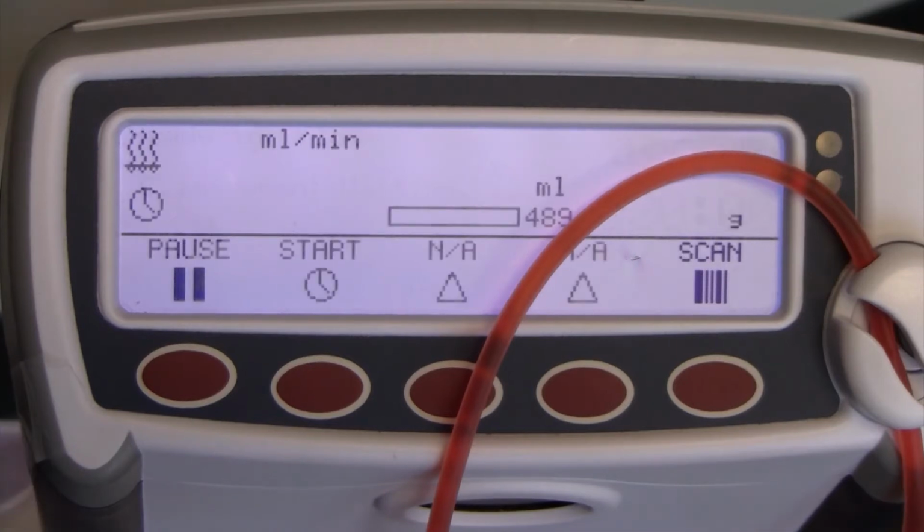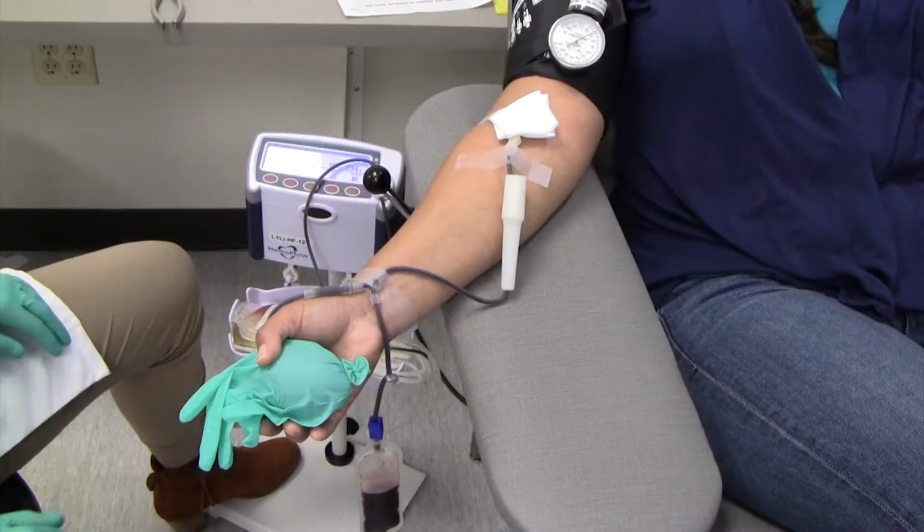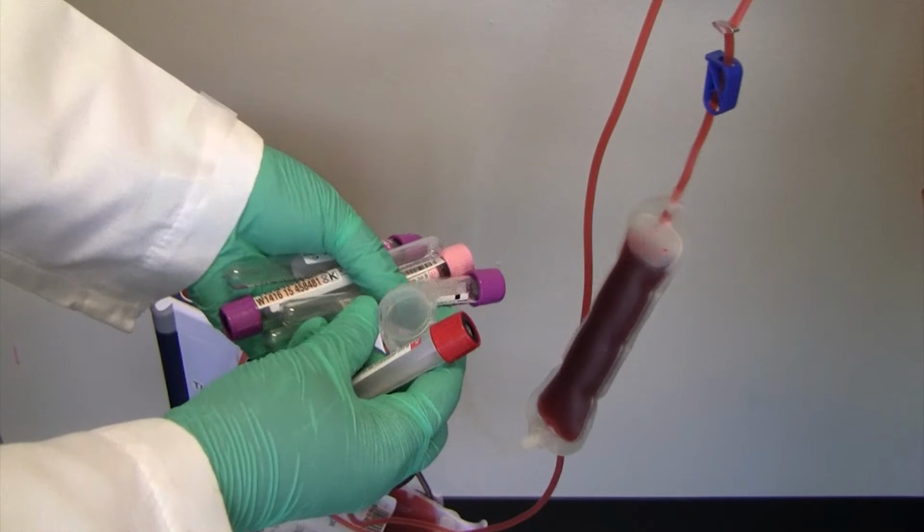Instruct the donor to open and close their hand approximately every 10 to 12 seconds. Reduce pressure on the donor's arm if necessary. Cover the site with gauze. Position the diversion pouch so that air rises to the top of the pouch. Open the lid of the vacuum tube holder. Draw samples.